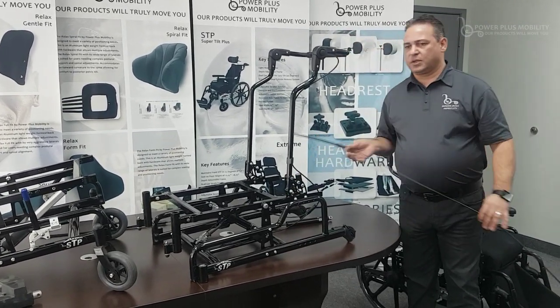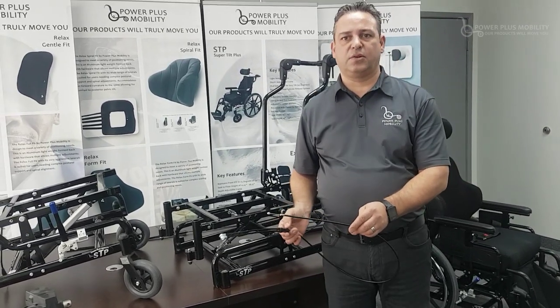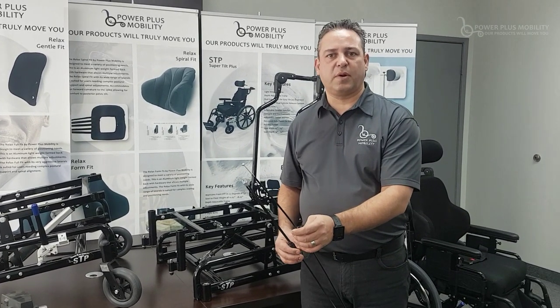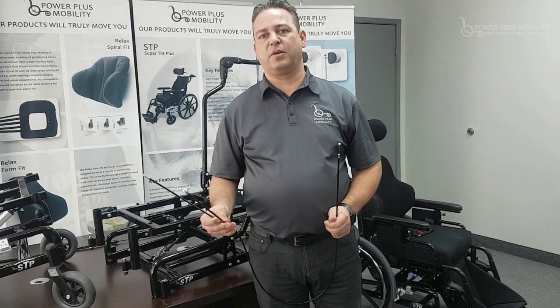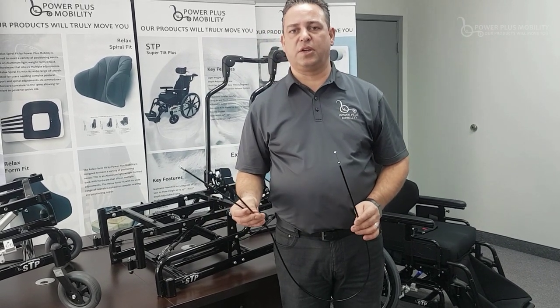Our cylinder cables look something like this. There are two heads to the cylinder cable — the initial cable is mounted to the trigger mechanism up towards the stroller bars, and the split cables mount to either the 200 or 400-pound cylinder, which is the standard cylinder we use on our chairs.